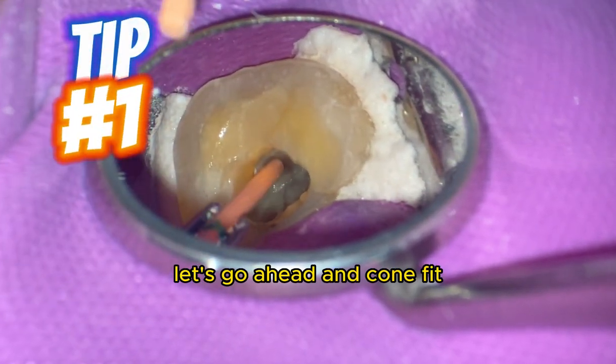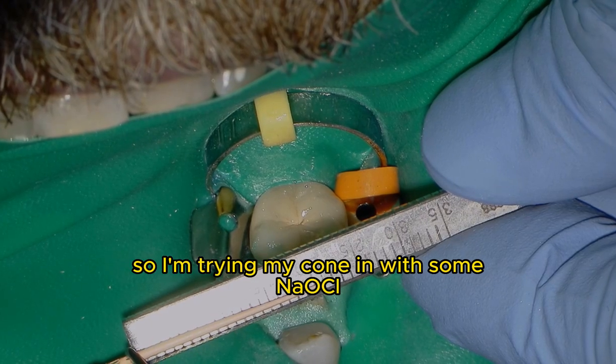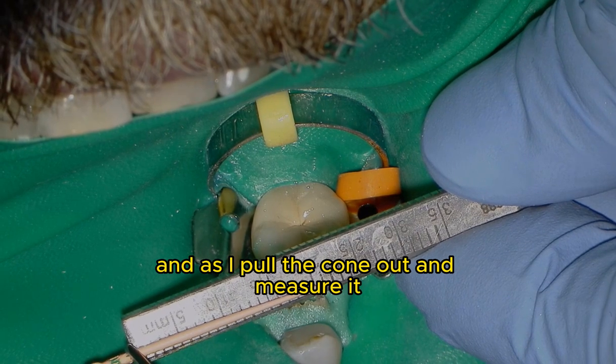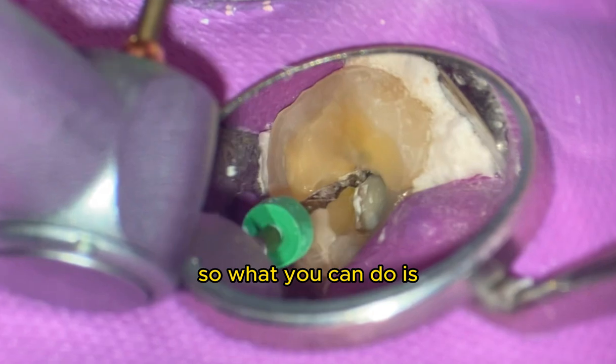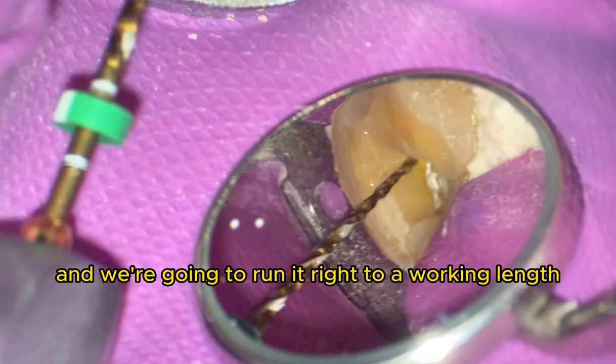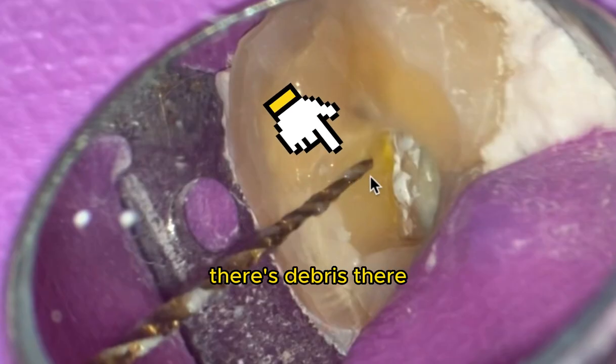Tip number one. Let's go ahead and cone fit. I'm trying in my cone with some sodium hypochlorite. As I pull the cone out and measure it, it is a bit short. So what you can do is run your file back to length — right to working length — and take a look at the apical part of the flute. Sure enough, there's debris there.